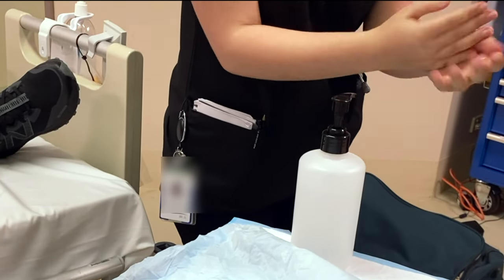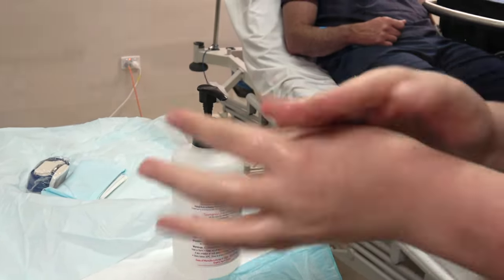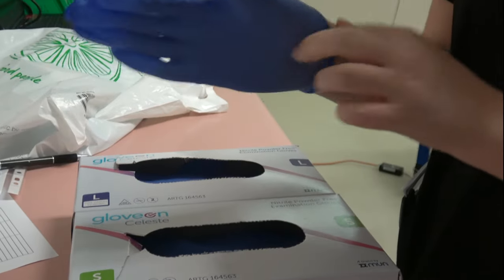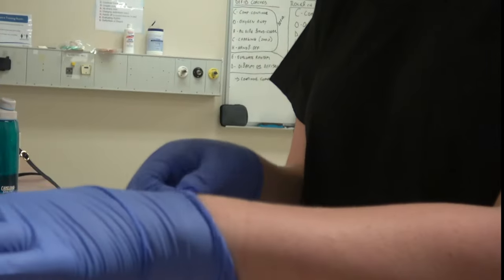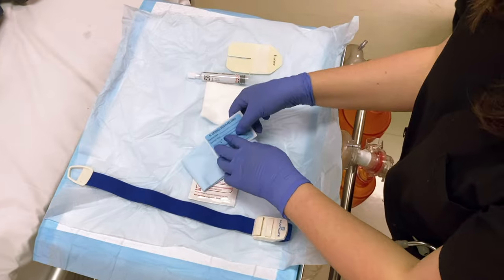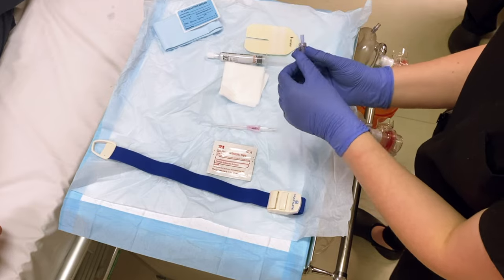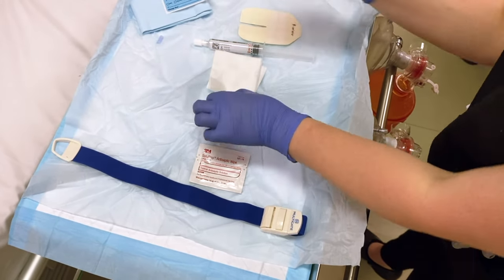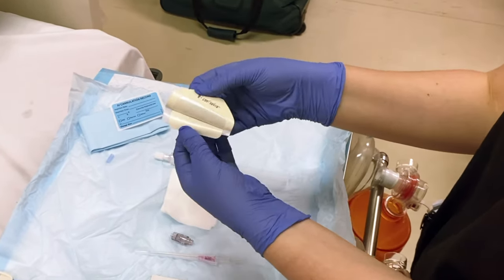You must perform hand hygiene before and after setting up the cannulation equipment. Since this procedure requires strict aseptic non-touch technique and ultrasound gel makes everything slippery, it is important to prepare all of your equipment in advance. Arrange your equipment in the order of use and bring the trolley close for easy reach. Uncap your bung, prime your flush and partially peel your dressings.